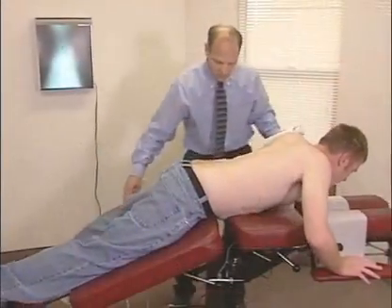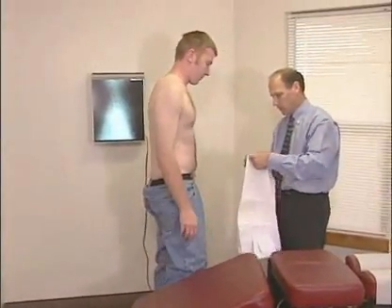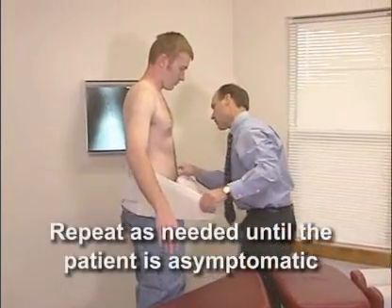After the patient dismounts the table, apply bracing. Apply treatment twice daily or until the patient is standing straight and able to dismount the table without sharp or jabbing pain. Repeat as needed until the patient is asymptomatic.